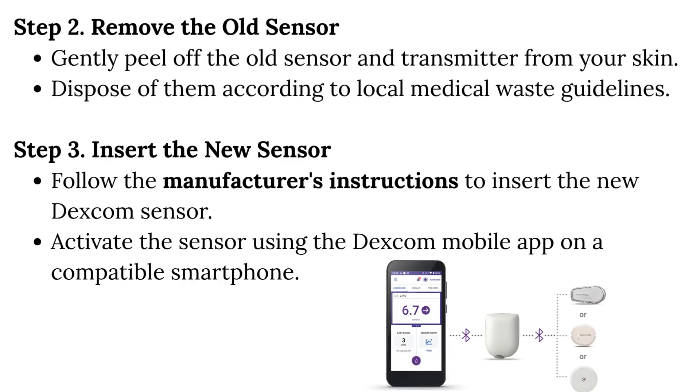Step 2: Remove the old sensor. Gently peel off the old sensor and transmitter from your skin. Dispose of them according to local medical waste guidelines.